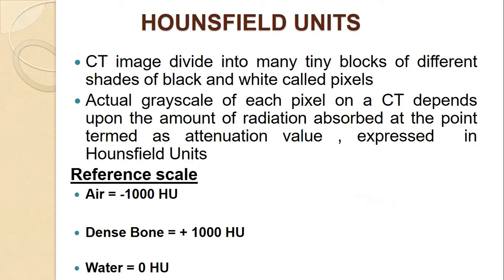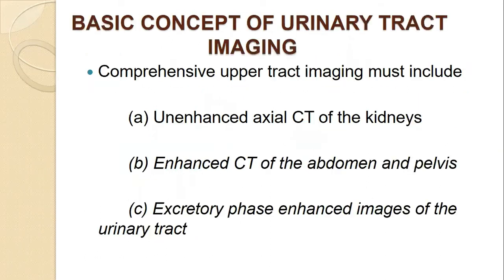This is expressed as Hounsfield units. For reference, air is -1000, dense bone is +1000, and water is 0. Others, like blood, angiomyolipomas, and tumors, have specific Hounsfield units.